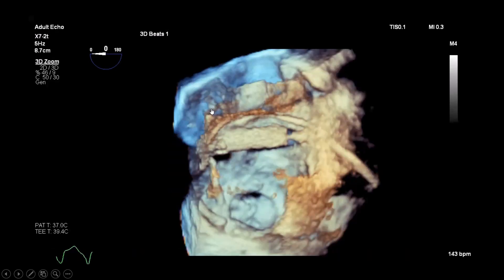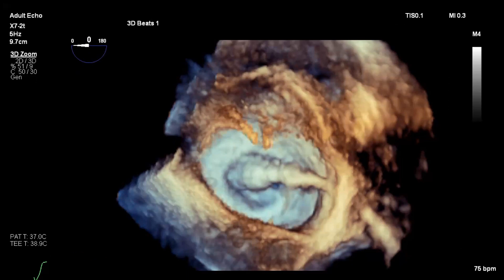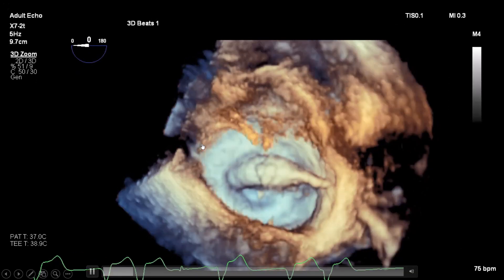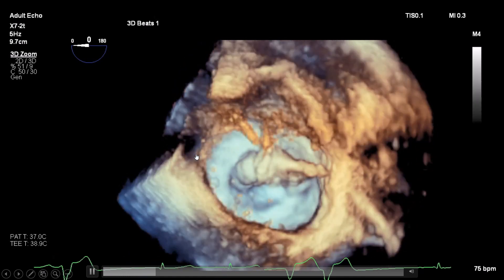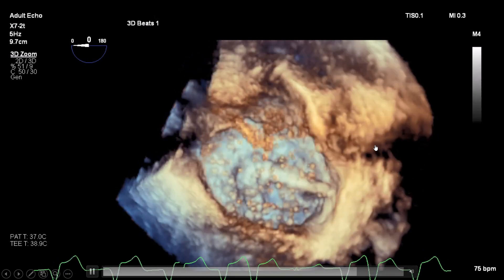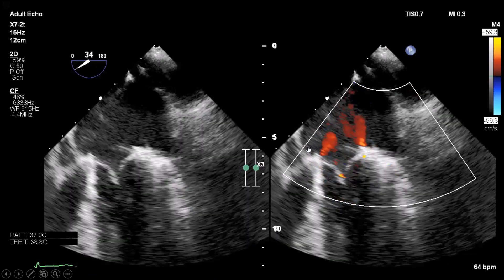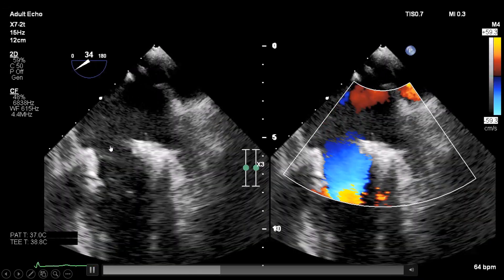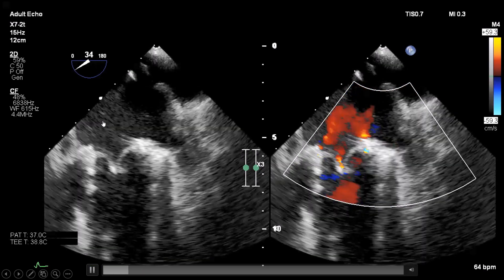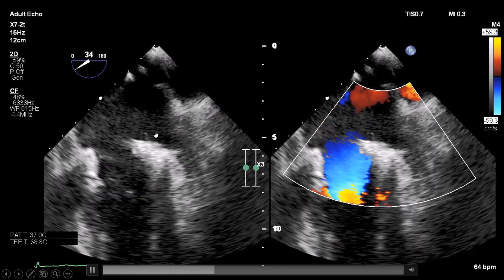The whole valve is now inside the left atrium. In the atrial view, you can see the prosthesis here, the catheter coming from the right side puncturing the septum, and both wires coursing the prosthesis down to the left ventricle. After positioning the valve inside the mitral bioprosthesis, you can see the positioning and then the balloon inflation. Now deployment of the Edwards SAPIEN within the bioprosthetic ring will happen, and a lot of bubbles will be obscuring the image.